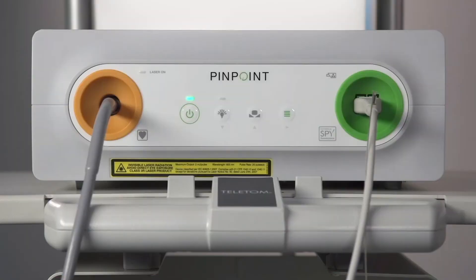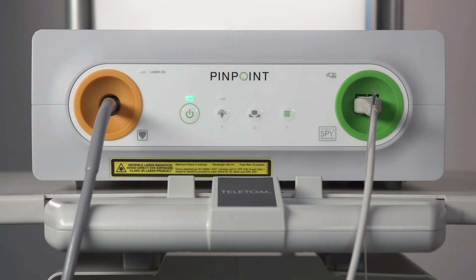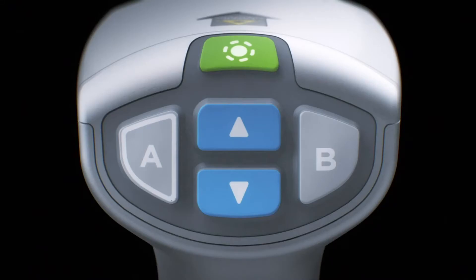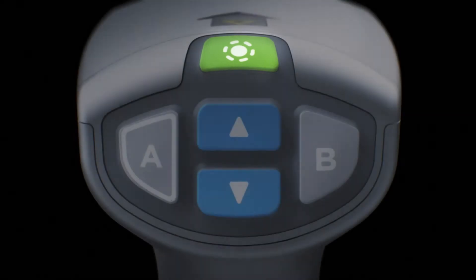Once the SpyFi is plugged in, covered with a sterile drape and powered on, the sterile operator has complete control from the sterile field. When ready to image, press the green illumination button to turn on the light source.